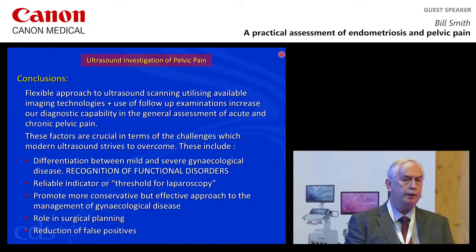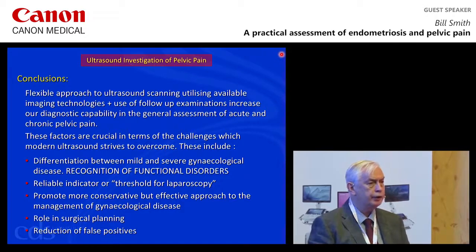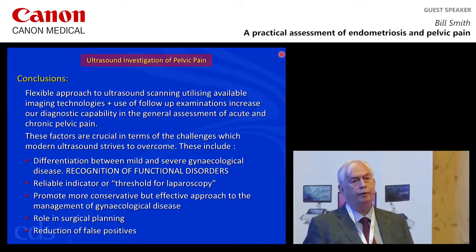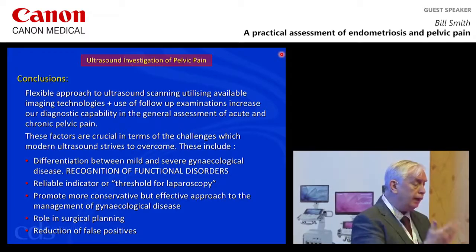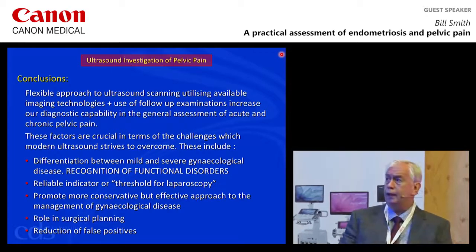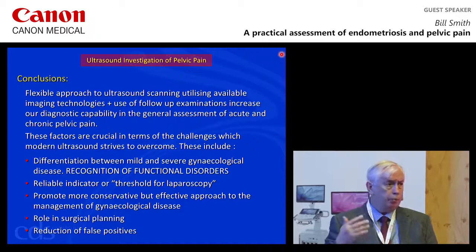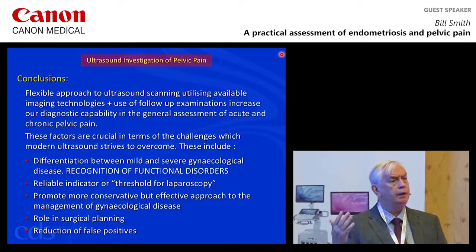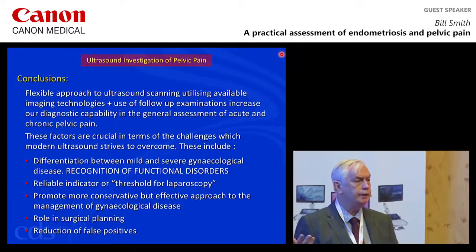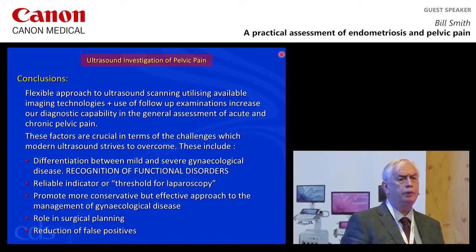So there's a very brief introduction to our thoughts, our impressions in terms of using high-quality ultrasound imaging, whether it's 2D grayscale, color Doppler, whether it's 3D, whether it's different scanning techniques, the value of follow-up scanning. And really, our challenge is to be more precise in our diagnosis and give the referring consultant more reliable information to work on in terms of clinical management.